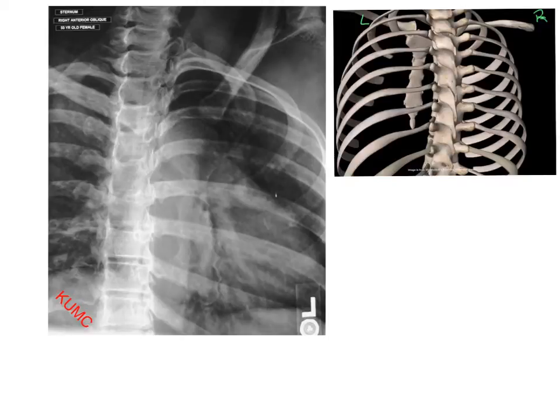Why do we do an RAO? Well, here's the patient's right side. We're looking at the right part of our screen. This is the position of the patient. The sternum itself is made of very spongy bone, and it is located directly midline of the thoracic vertebrae. So we are unable to get a really good look at it in AP view.